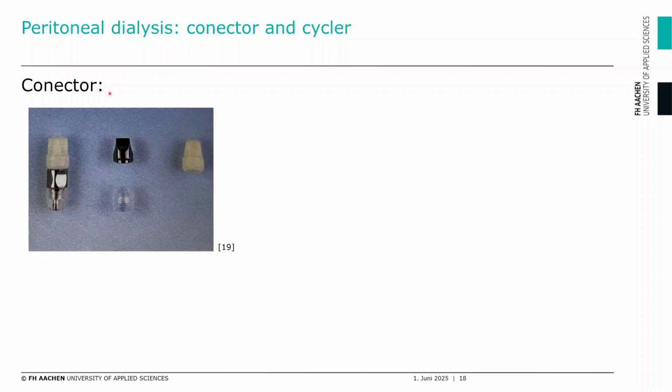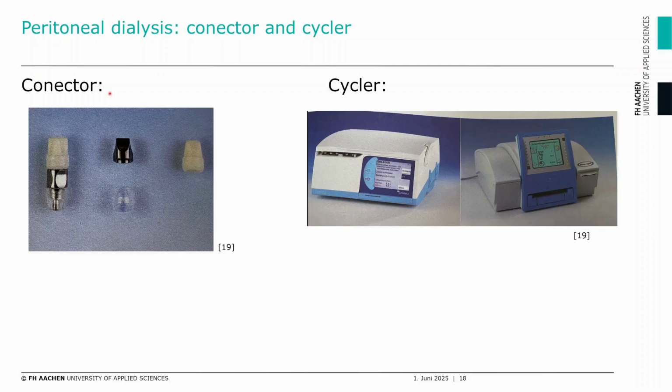In automatic peritoneal dialysis, a peritoneal dialysis machine called a cycler is used. The data required for the treatment is entered into the cycler manually or via a chip card: total dialysis exchange volume, abdominal fill volume, duration of treatment, and tidal volume. The machine then calculates the number of exchange cycles and ensures that the solution is heated and the dialysis inflow and outflow is controlled by means of a valve mechanism.